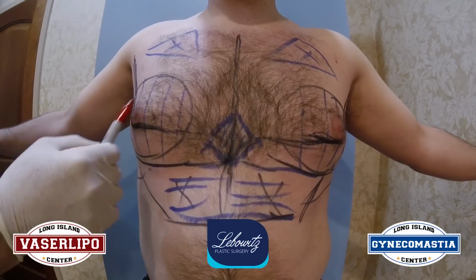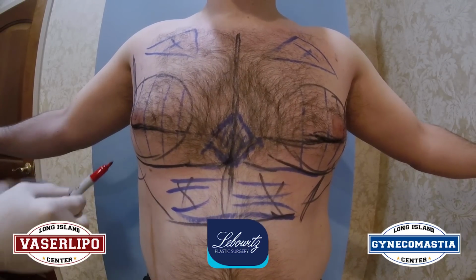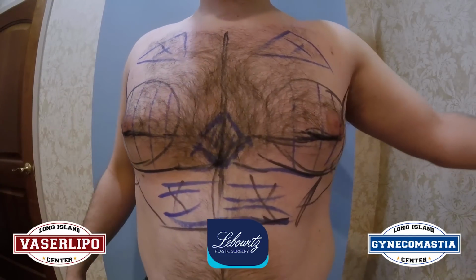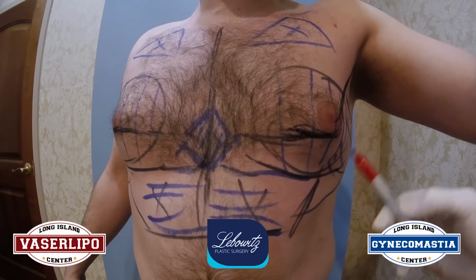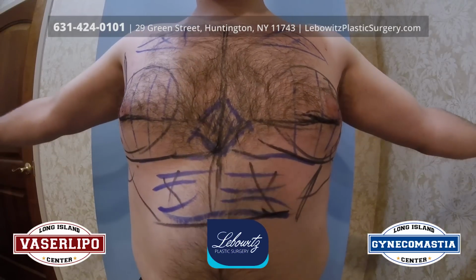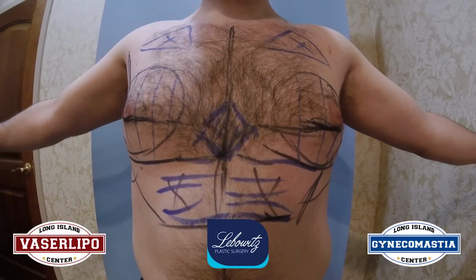And that's the gland that we have to remove, that rubbery gland that won't be removed with the Vaser itself. And then he's going to have a little bit of a 2 millimeter stab right there to get that shape. Through this little one, I can Vaser all around and up and be perfect. That's it. These are my markings for the high definition Vaser liposuction and gland removal for extraordinary results.